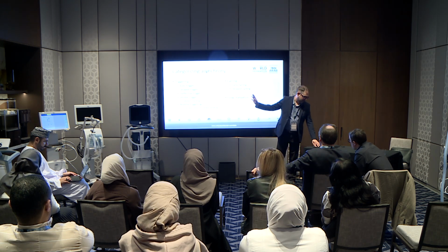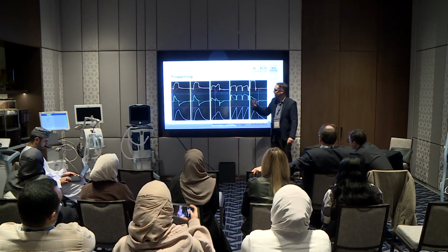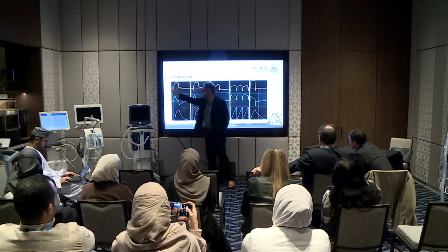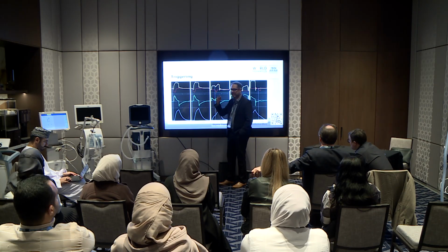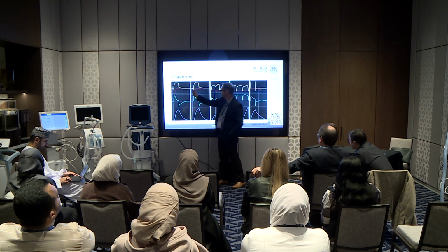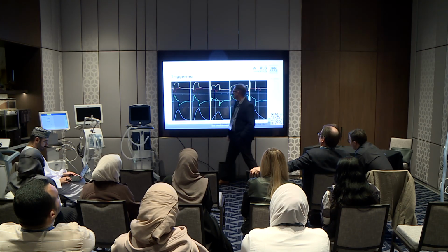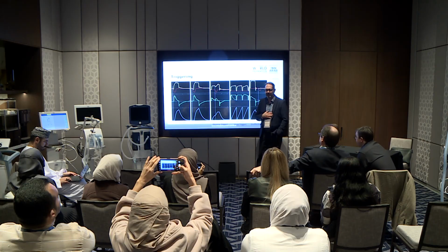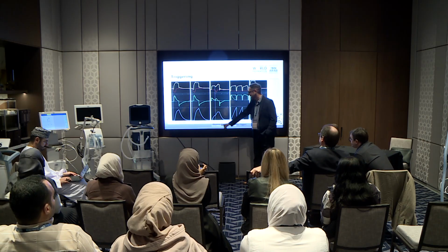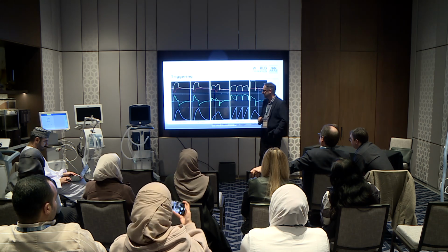Now, let's just talk about triggering and cycling first, and then I'll get into how I like to classify them. So triggering, this red line represents PMUS. You see the breath is triggered there. This is late trigger. It just means the patient's making an effort, but there's a wider gap between when they finally trigger the ventilator. And then in this paper they call it early trigger. I'm not a fan of that. Reverse triggering is what we've been referring to it since 2013, so I'm going to keep going with reverse triggering.